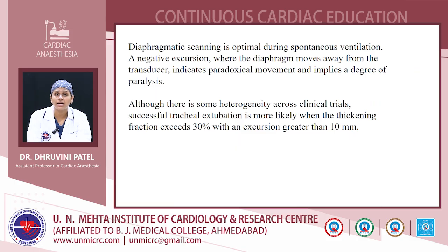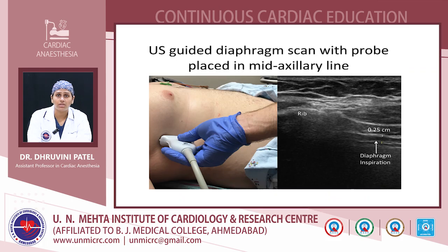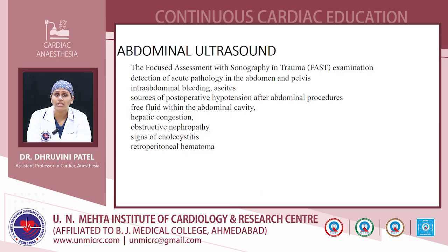Some trials suggest that successful tracheal extubation is more likely when the thickening fraction is greater than 30% with excursion greater than 10 mm. This image shows the ultrasound-guided diaphragm scan with the probe in the mid-axillary line.